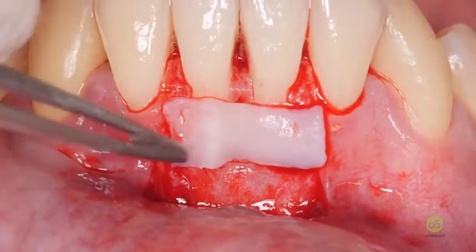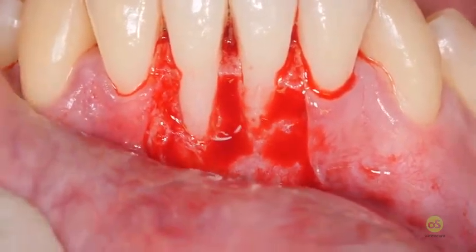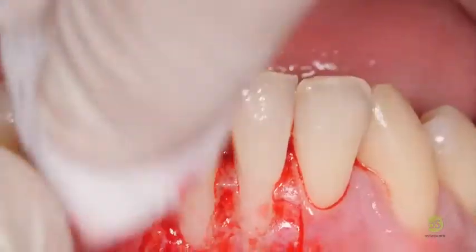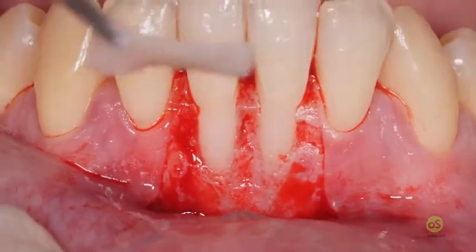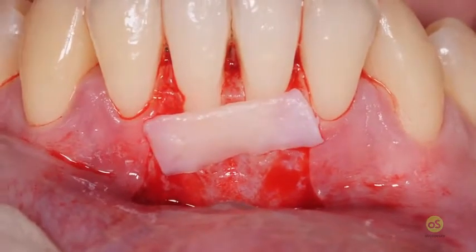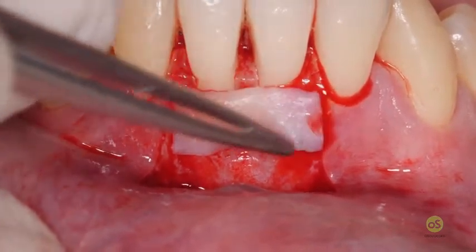This should be placed so that there is a very, very good adaptation also to the area of the bony defect, because in this area this connective tissue graft is working as a barrier to prevent the flap from collapsing, and so we will improve the buccal lingual dimension, the buccal lingual level of the bone also.